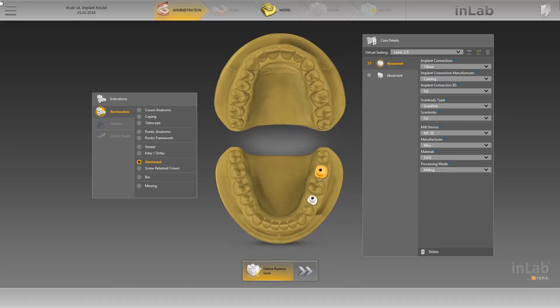In our example, we have already imported the model data via the Serona Connect portal and created a corresponding case in the administration phase. Therefore, we'll now switch directly to the model phase by clicking on the double arrow.